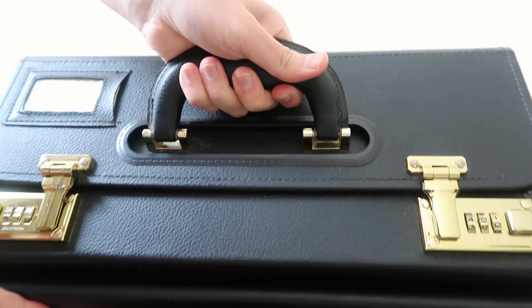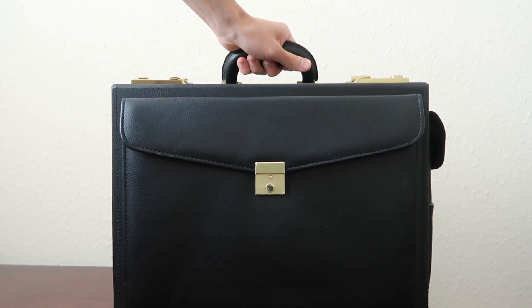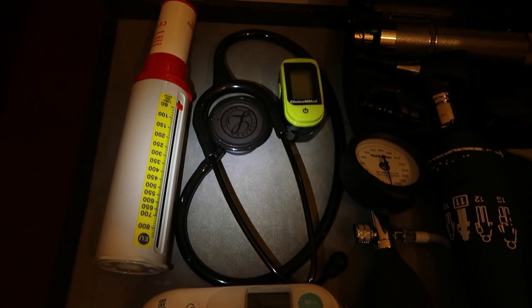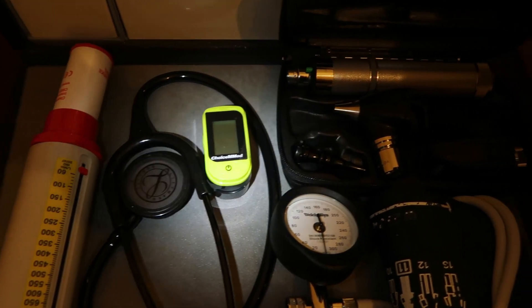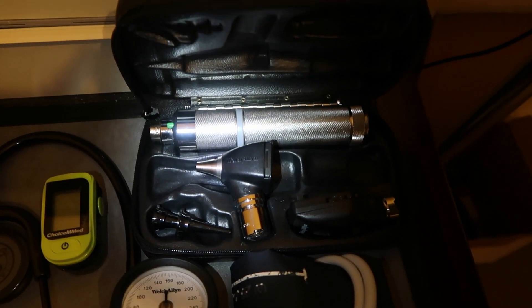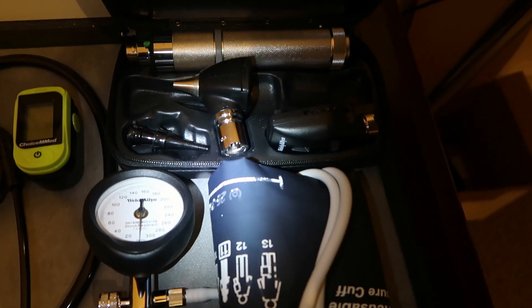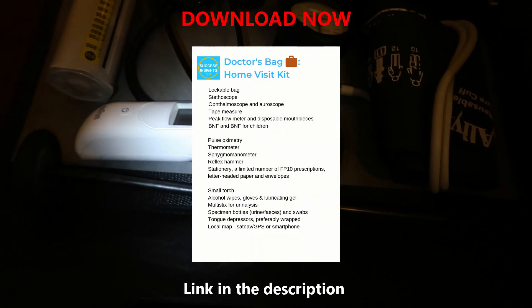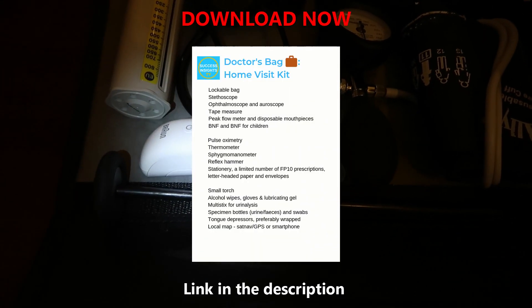I'll lock the bag again. This is some of the basic equipment you'll need to carry out a house call. You may also wish to carry a prescription pad with you and medication. If you have any questions about equipment or the bag that you need for your house call, write it down in the comment section and I will answer your question.